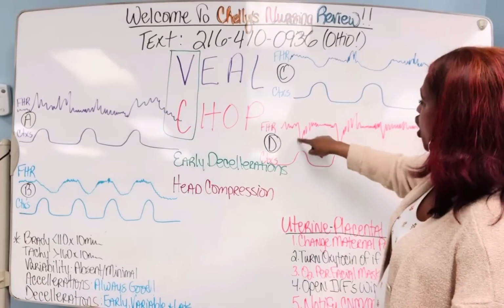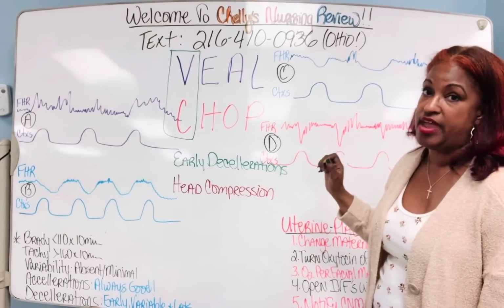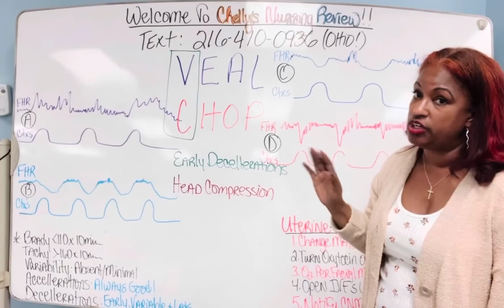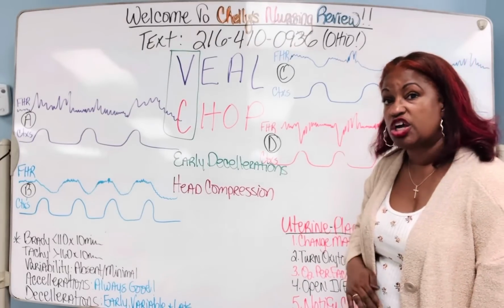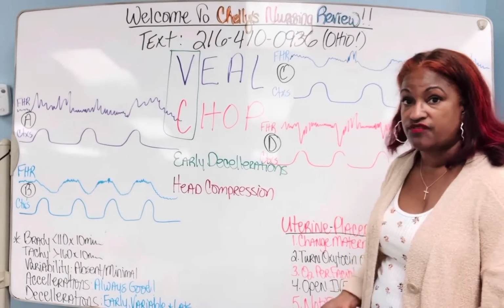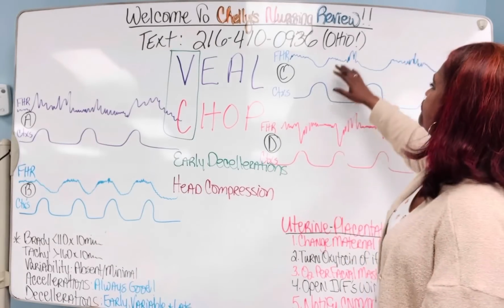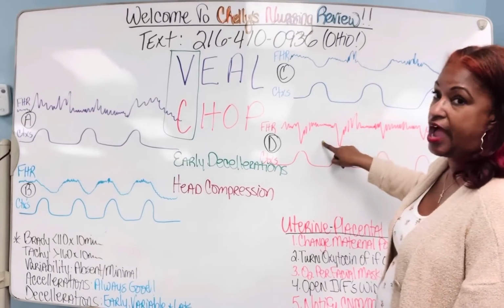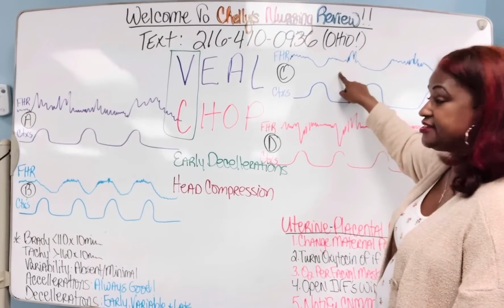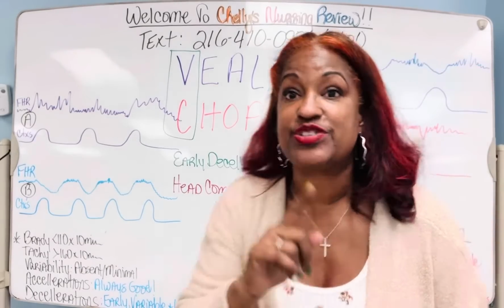It's not sharp like the variables were. The variable was the patient who had low amniotic fluid and, you know, her baby was smaller, her belly wasn't measuring very well. She was a victim of domestic violence, okay? So these are two different strips. This is not good. This is actually really good, except you still got to do some stuff.